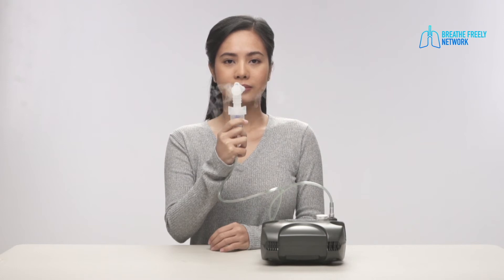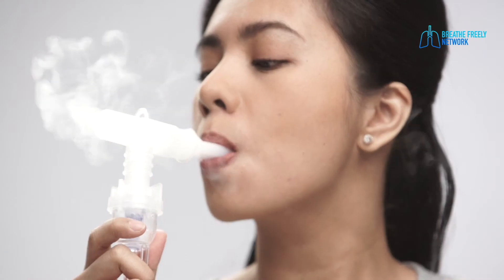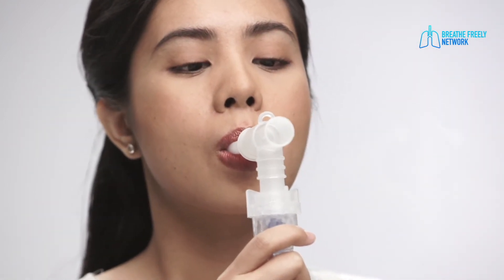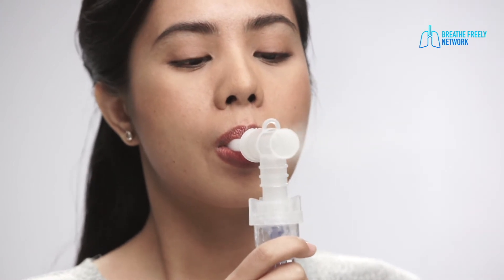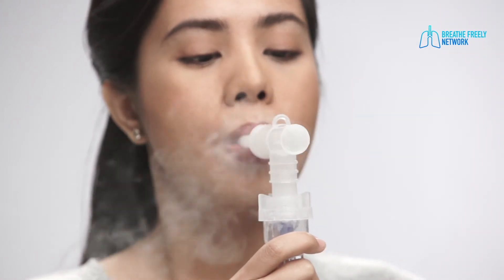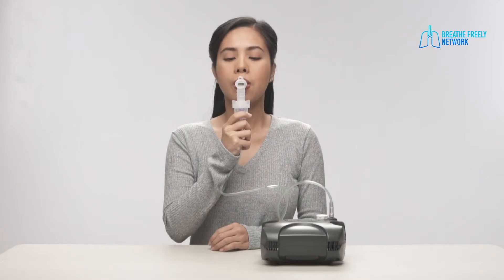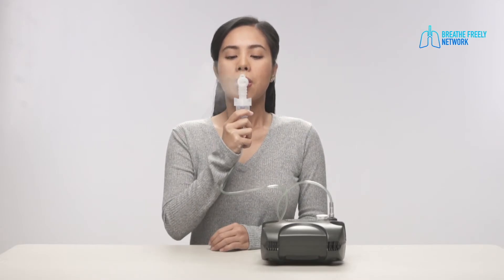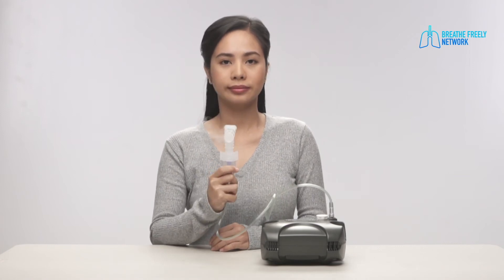Take slow deep breaths through the mouthpiece and inhale all the medicine. Close your lips around the mouthpiece so no air leaks out. Continue taking slow deep breaths until there is no more mist coming out of the face mask or mouthpiece. When the mist stops, the treatment is done. This could take 10 to 20 minutes depending on the machine and the amount of medicine.